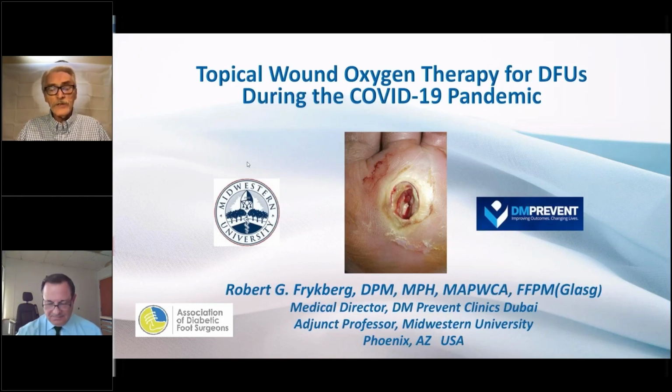Now, this device is delivered to a patient's home. The patient is trained on how to use it, and then the patients can deliver the therapy themselves each day, 5 days a week, for 90 minutes a day. It's just putting their leg into an extremity chamber and making sure that the upper part is fully sealed, like with a Velcro wrap. So it lends itself perfectly to this, where the wound center without walls now is focusing on telehealth, telemedicine, as well as community-based care.